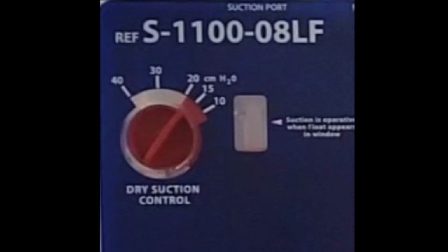The regulator on the wall does not manage the patient pressures. This is set by the device. For example, if your device is set to 20 and the wall regulator is at 40, that's okay, as the suction is determined by the device.